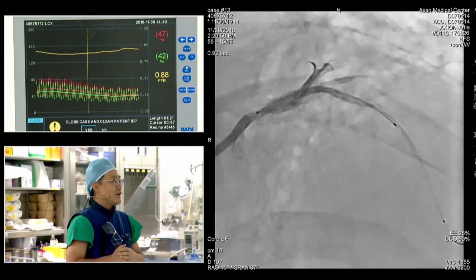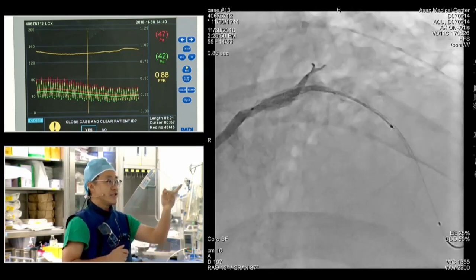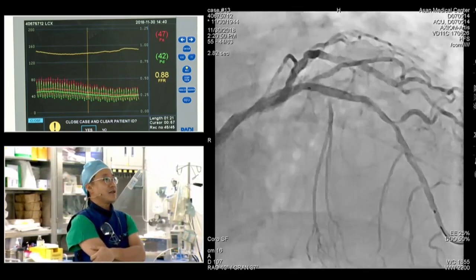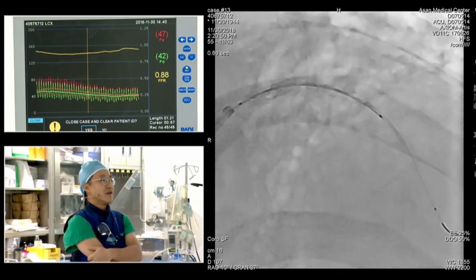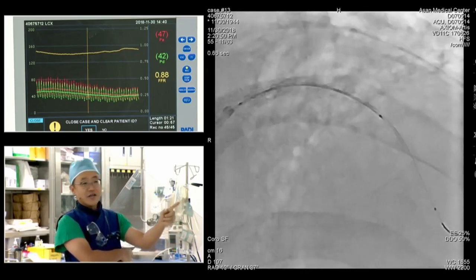And then we finally checked the target area with co-registration OCT again. Could you show us the OCT finding? Looking at the distal part, it's well expanded. There is some protrusion of a plaque. Compared to the first, see the image. Oh, can you see the OCT?